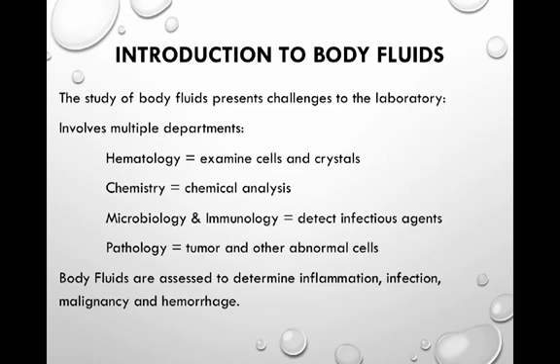The hematology laboratory usually receives fluids for cell counts and morphological evaluation. We're looking for types of cells, and if they are found, we need to concentrate them and identify them, and that's going to help give information to the clinician in arriving at some kind of diagnosis for the patient. Cells can be found in these fluids, anywhere from white blood cells and red blood cells. Sometimes we'll see tissue cells, and sometimes we can actually see tumor cells. In synovial fluids, we may also look for things like crystals.